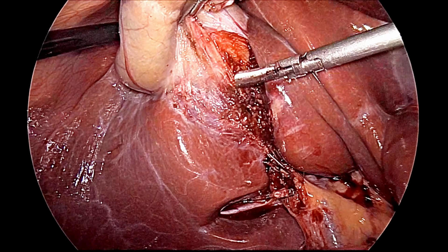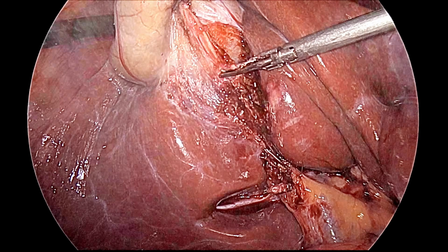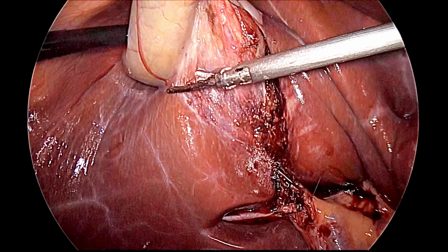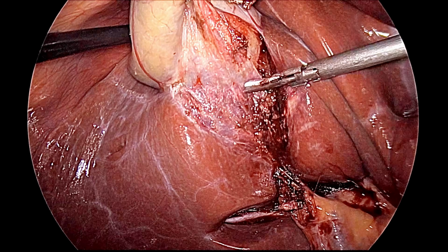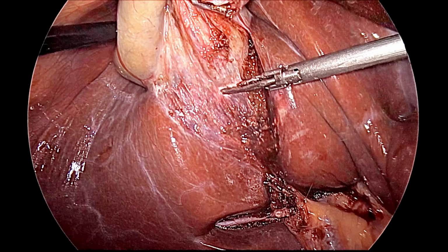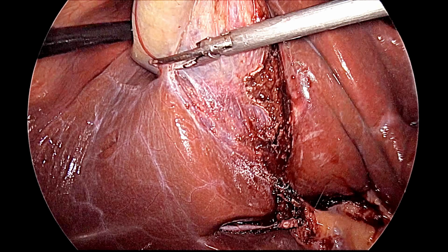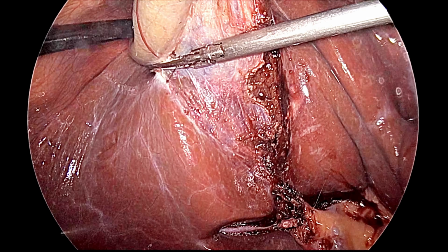During that, your left hand should give gentle traction, and anteromedial and anterolateral traction should be given to get a complete areolar tissue plane. First we should catch the peritoneum, that is called the shoulders of the gallbladder, and then only you will have a good areolar plane. We should try to avoid the parenchyma of the liver, but with a very thin gallbladder sometimes in a soft liver, if it is detaching, then we should try to avoid it.